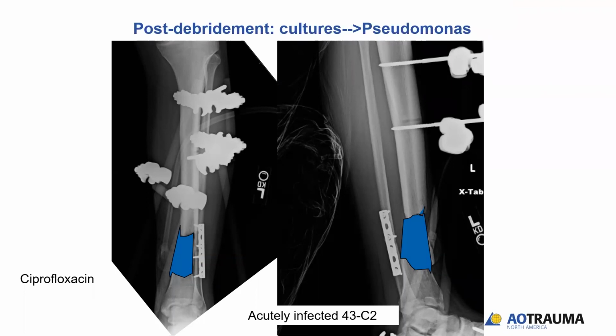I'm trying to get to a nail too, but I don't like the X-Fix on there, so I've been doing a submuscular antibiotic coated plate. I can get the X-Fix off, put it under a big muscle flap, and then let everything calm down. Fix the joint, but then that plate can get taken out pretty simply, and then I'm a little less nervous about the acute nail conversion to either one of Mitch's fancy distraction nails, or even into a transport situation over a nail where I have less concern about canal contamination. Yeah, I think that's a great point.